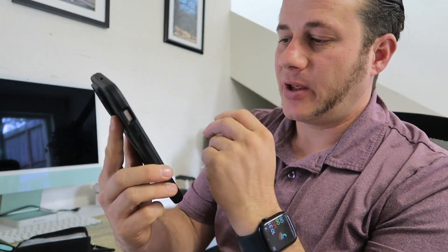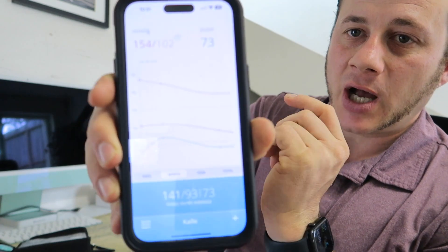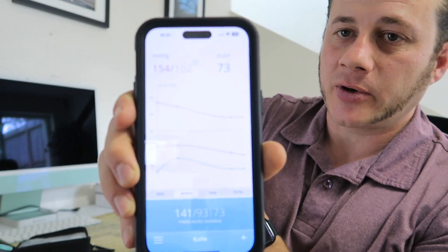Let me pull that up to show you. It's called Balance Health and it shows you a graph. Some of these readings are very high, but you can put all of your data in there. You can change settings and it shows you how things are trending — you can see mine is going down, so that's good.